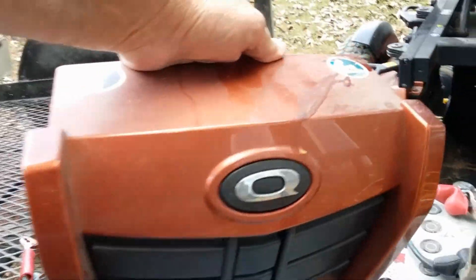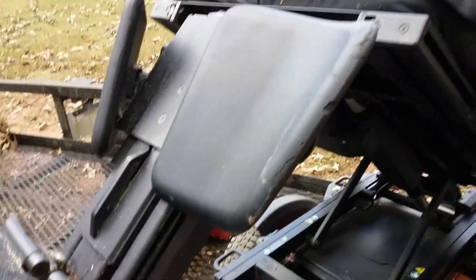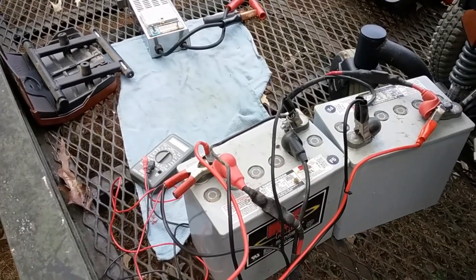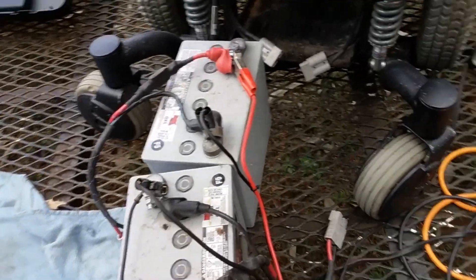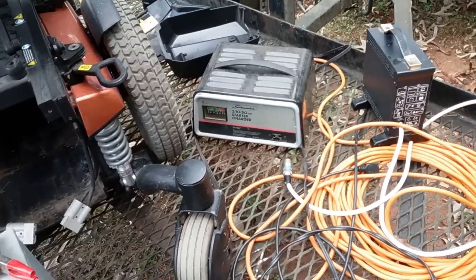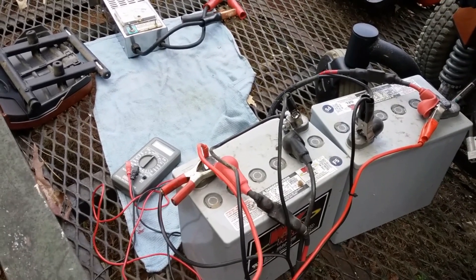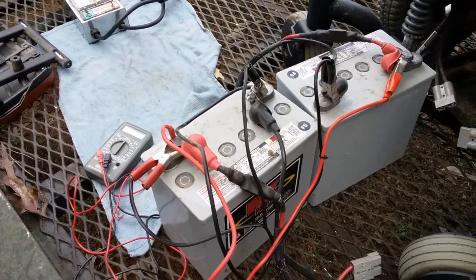This cover is pretty heavy and it's behind the chair mechanism, so the only way to get to it is to rig it up and tilt the chair backwards. I've got it tilted backwards right now and I've got both batteries charging at the same time. They were dead — they only read about seven and a half volts when I checked them. The voltage was so low that the small charger that comes with it would not activate. It has a safety feature that won't let it charge if the batteries are too dead. We're going to hope they take a charge — if not, I'll be headed to the store to buy two new batteries.